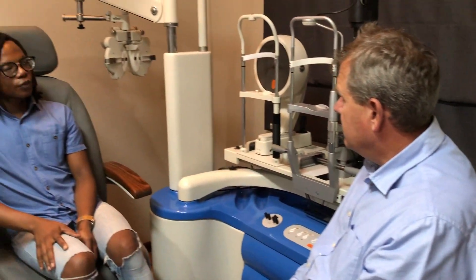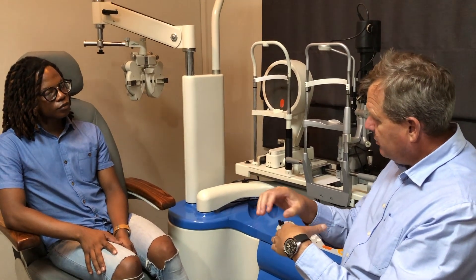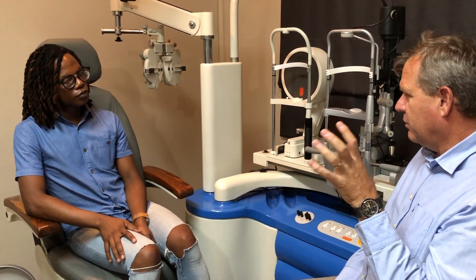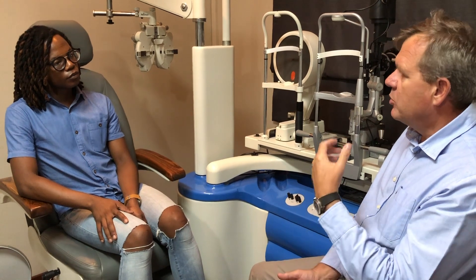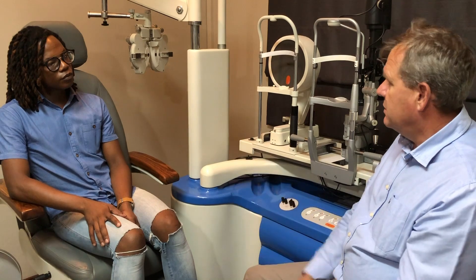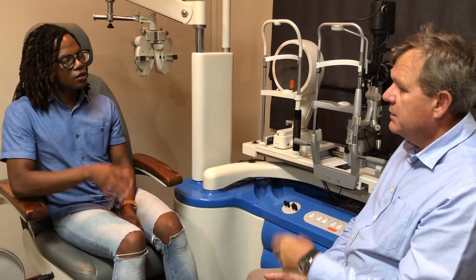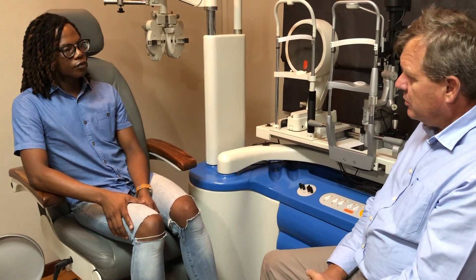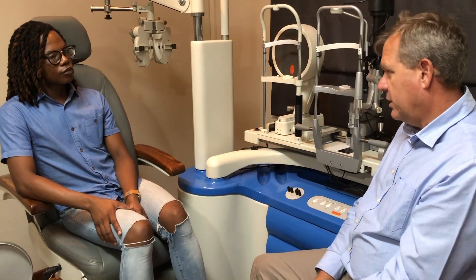Or we can use a contact lens. We can make the surface of the lens what we want, and the tears between the lens and the eye take the distortion away. That's the old way that we've been doing for years to correct this condition. Now you get normal hard lenses or RGPs which are small, or we can have bigger lenses — the scleral lenses which Jeremy spoke to you about. Or even we can do a soft lens. Everybody's different and the trick today is to figure out what you're going to need.